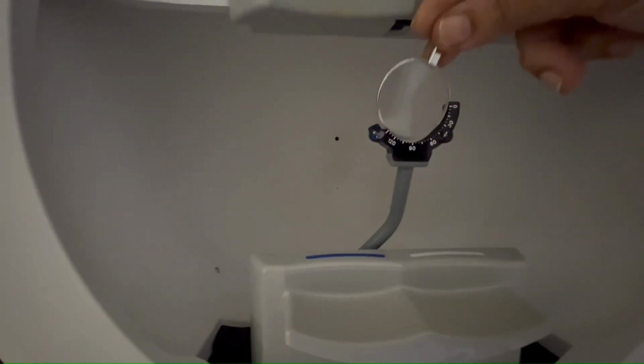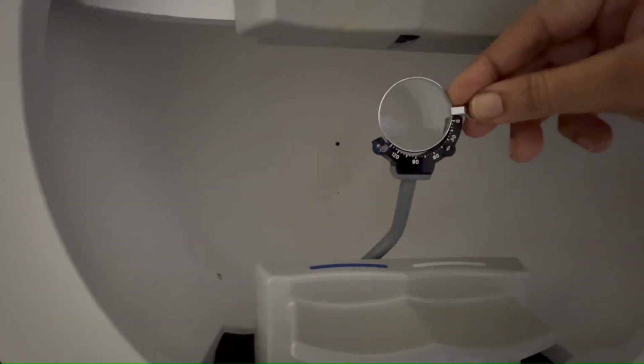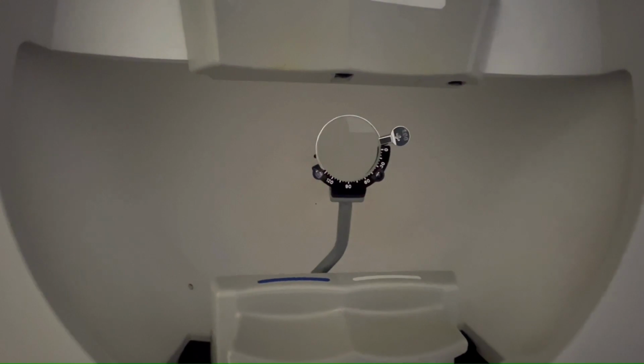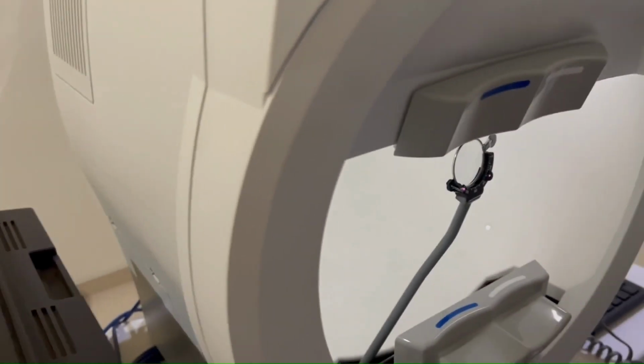Move the trial lens into an upright position from its storage position in the bottom of the bowl. Place the spherical lens in the slot closest to the patient and the handle to the right for the right eye and to the left for the left eye. Place the cylinder lens, if indicated, in the slot farthest away from the patient and align the axis.